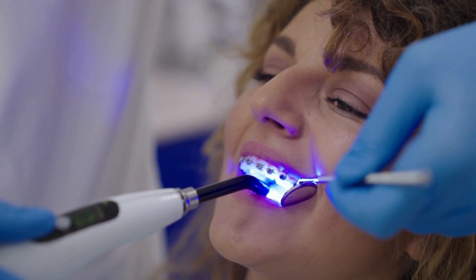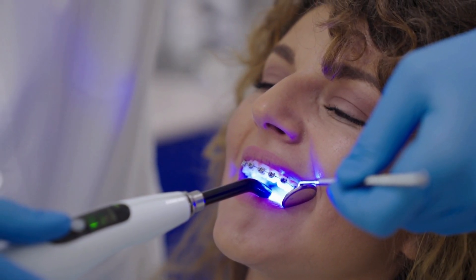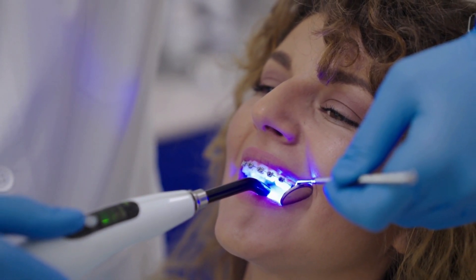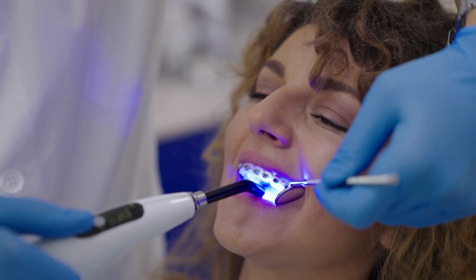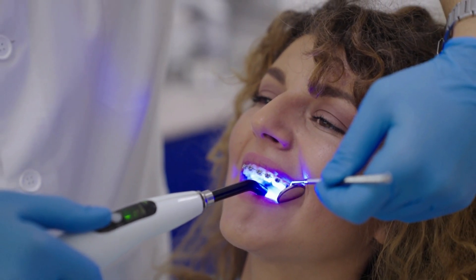Beam filling device: LED or halogen lights are used to ensure that tooth-colored composite fillings adhere to the teeth and reach the hardness of the tooth tissue. This light allows the filling to harden.